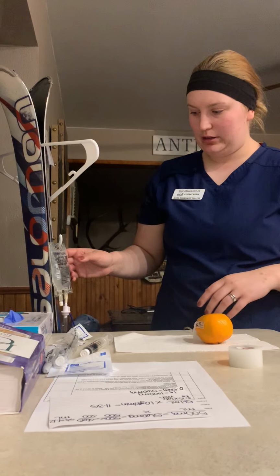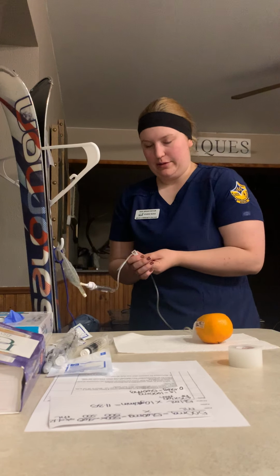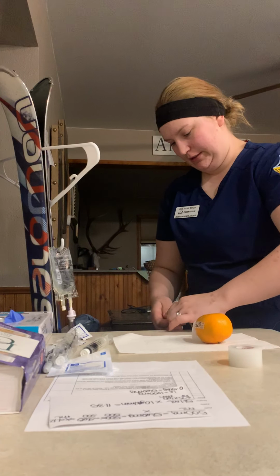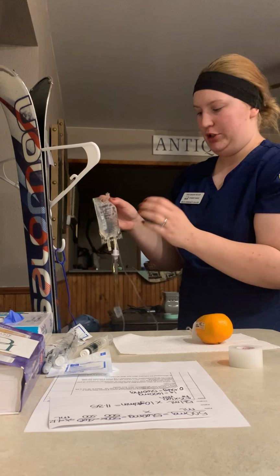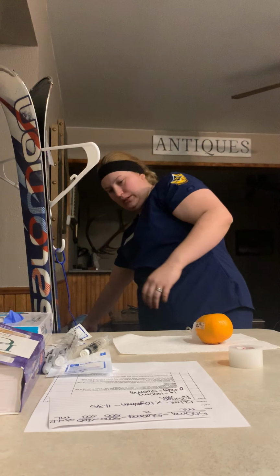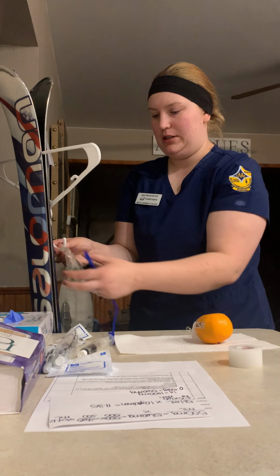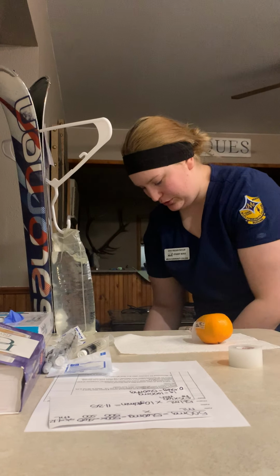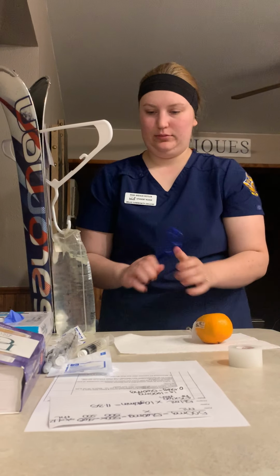And then when it's finished, you would just roller clamp this one shut. You can unhook. And then when you're tossing this, making sure no patient information or anything is on there. And then you can restart or readjust the dosing on your primary line, and making sure you adjust your clamp too, so it continues. And that's it.